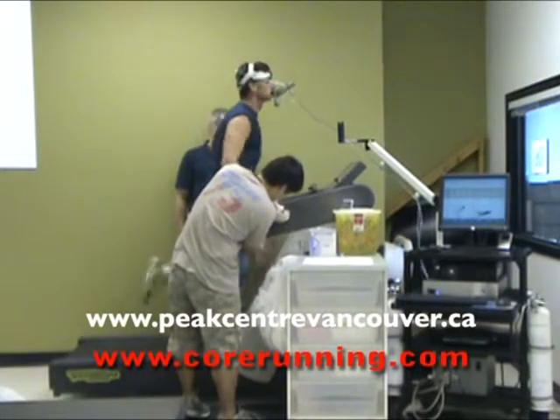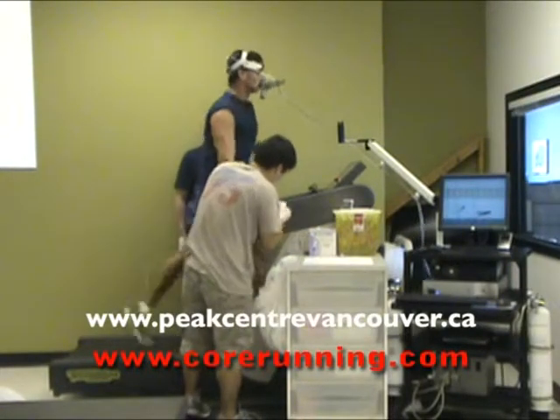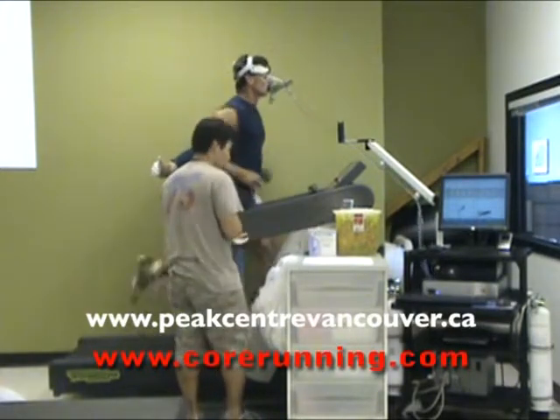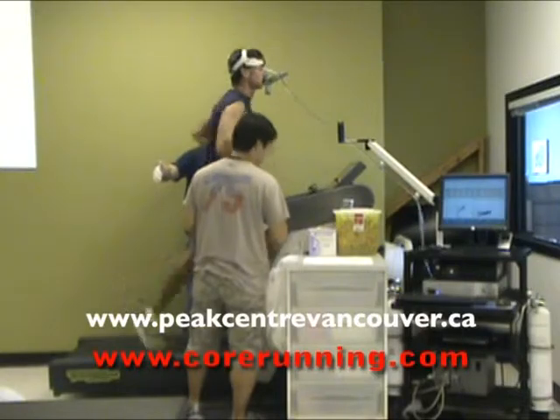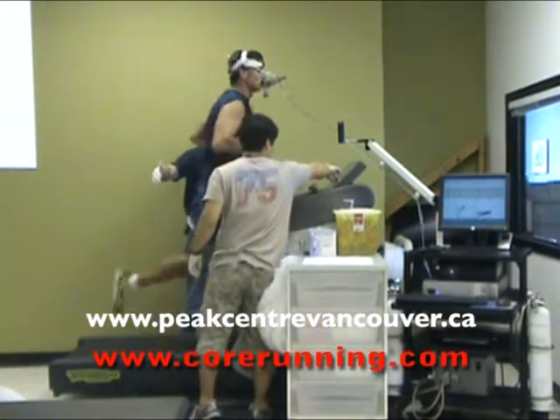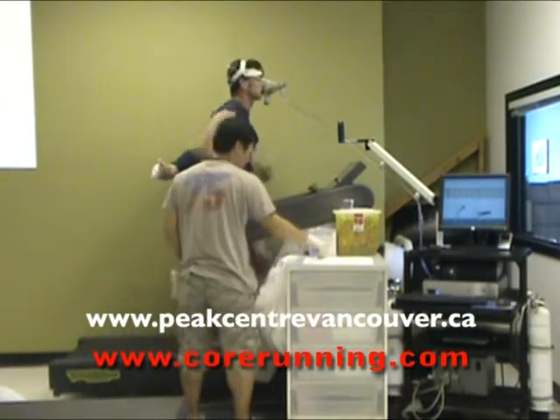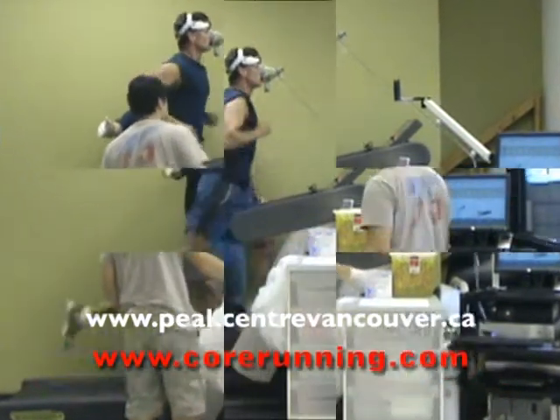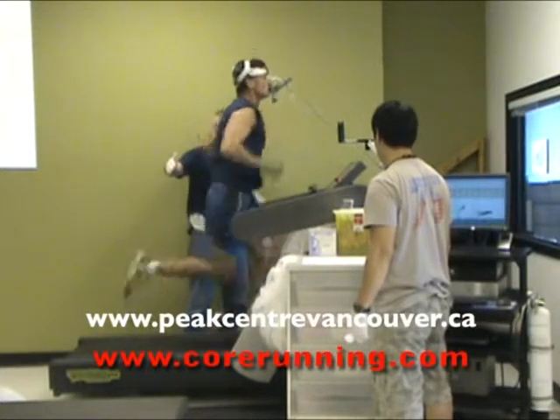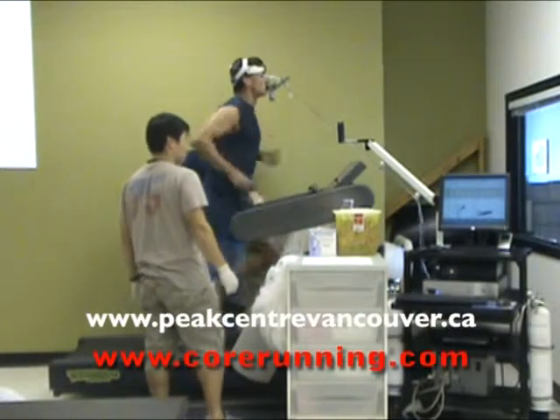Nice and relaxed. Maybe you can give me a minute in this next one. Stay relaxed. Nice work, man. You have 20 seconds left. When Paul gives you a big countdown, you can just grab the front and hustle. Hustle a little bit. Turn it all the way through.